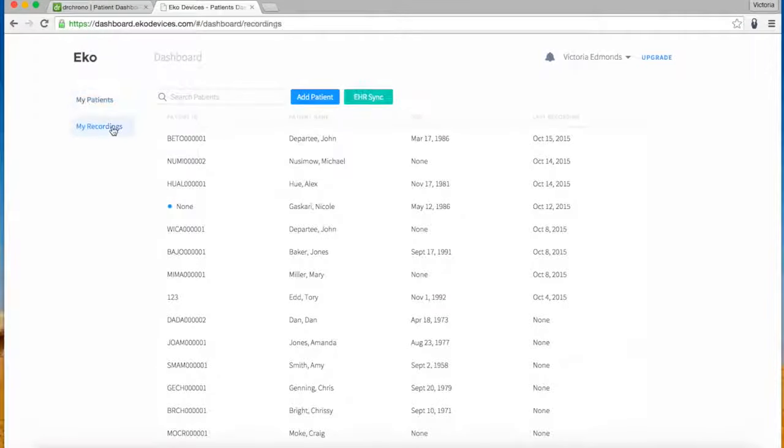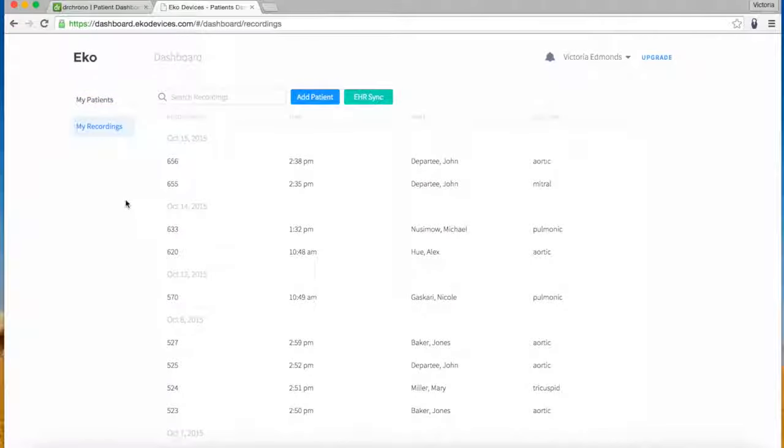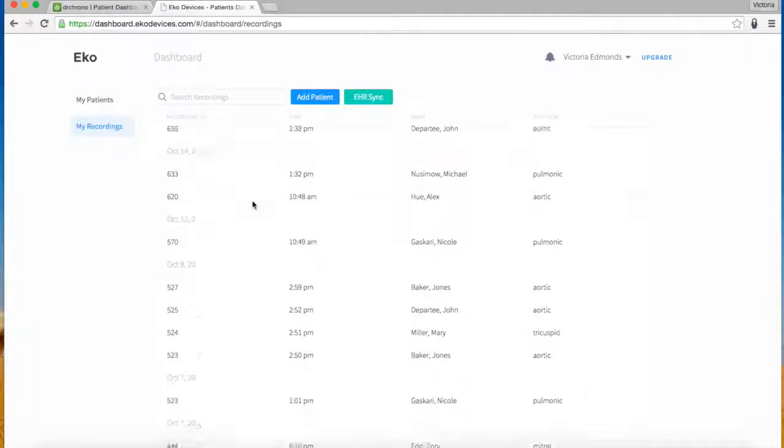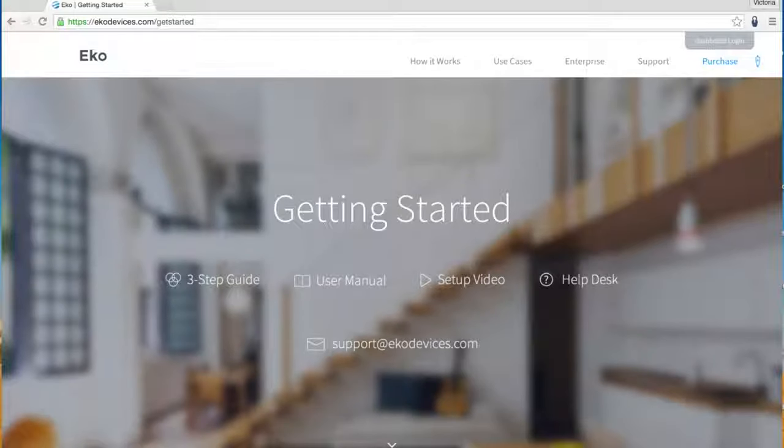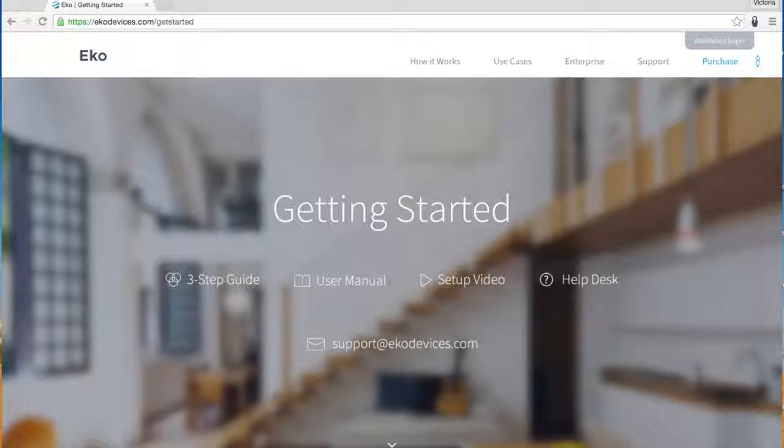This concludes our Eko drchrono tutorial. Visit ekodevices.com/getstarted to learn more about the Eko drchrono integration.